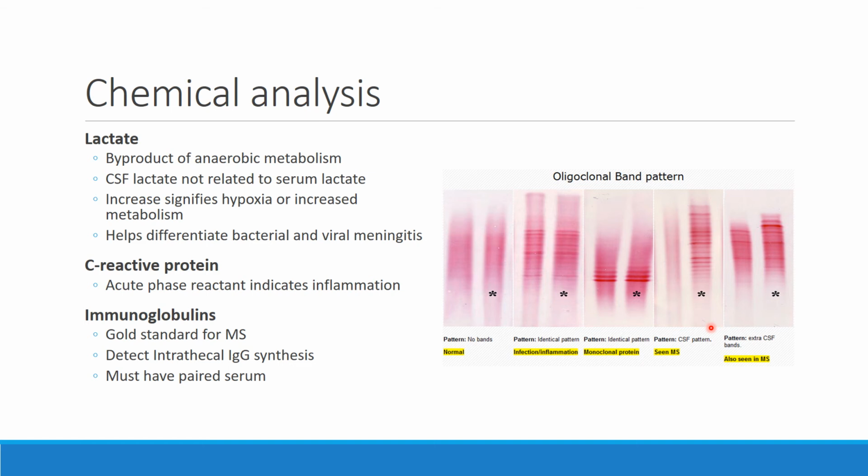The key thing for us in the laboratory when we're doing oligoclonal banding, and it's actually one of the things that we end up running around about, has to do with processing. We get that CSF specimen in, and they don't send us the blood. We need the blood. We can't send this specimen for testing without that blood. So that actually becomes one of the issues for our processors. They end up sort of chasing the physician around: I need that blood. And it sometimes takes a while for us to get it. But that's how that specimen is interpreted.